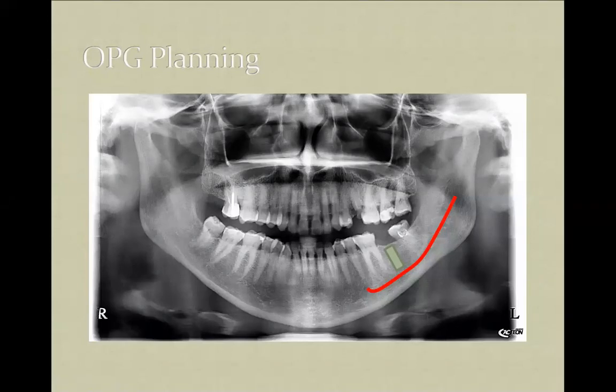But nowadays, we have cone beam CT scanners and surgical planning systems, and it is a very, very precise system. I'm going to show you on the next slide. I just want to finalize this one. It allows you to pre-plan your surgical procedure, including diameter and length of the implant, and even prefabrication of the surgical templates, surgical guides.